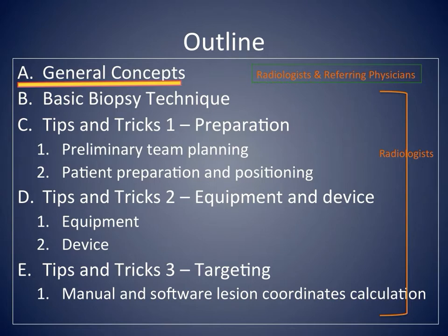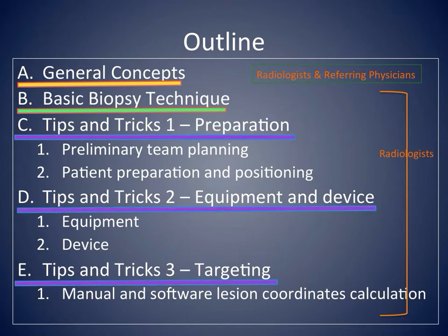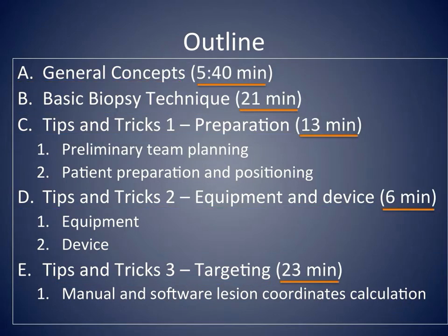The basic biopsy technique is an overview of the entire procedure, and the following 3 sections have technical tips and tricks for radiologists that perform the procedure. The duration of each section is shown here, and the links for each section are listed in the YouTube description of the video.